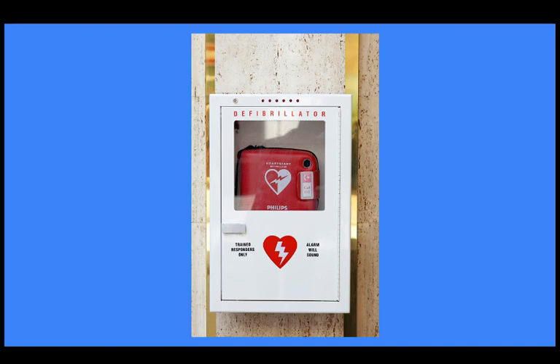If the person has an implanted device, such as a pacemaker, you will see a bulge over their chest. Place the defibrillator pads as close to the correct position as possible without being directly over the device. For people with medical patches, remove the patch, wipe the skin dry, and apply the AED pads.